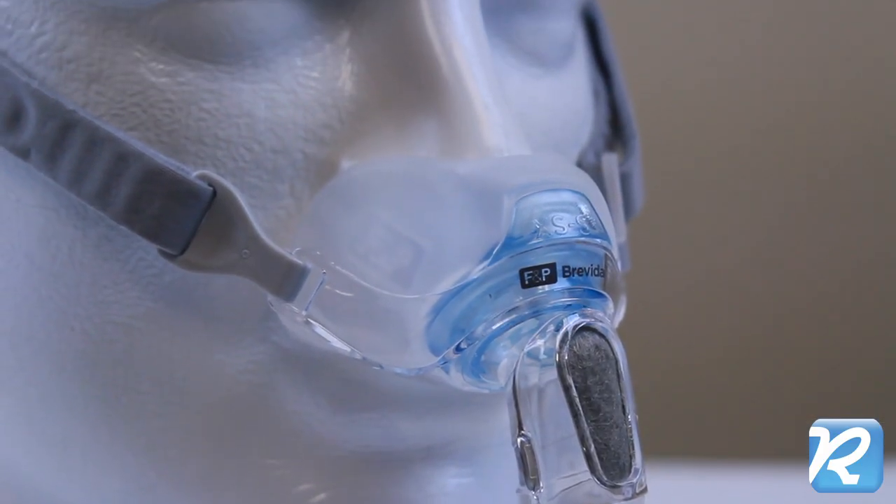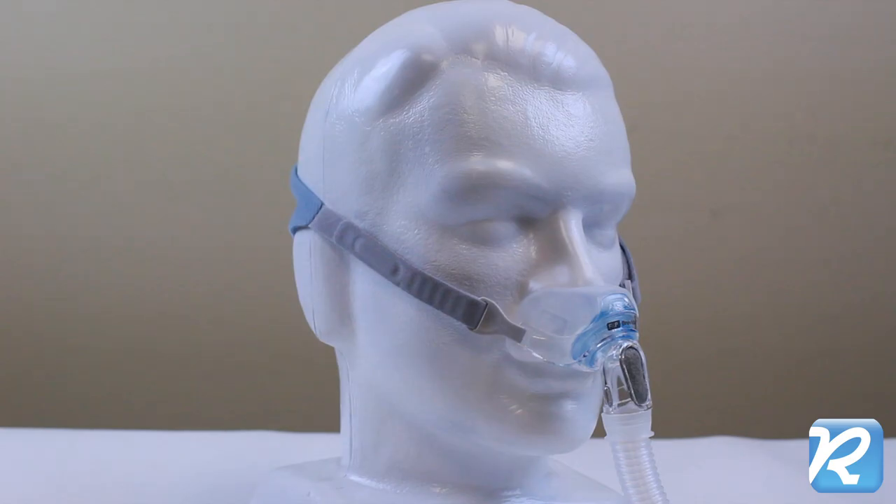The Brevida ships with extra small, small, and medium large sizes of nasal pillows.